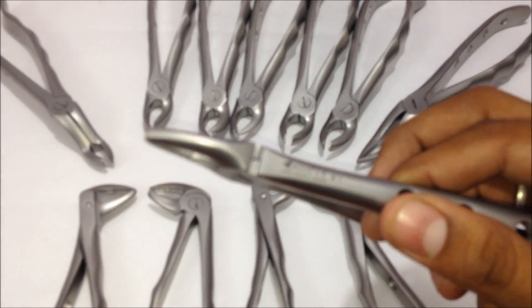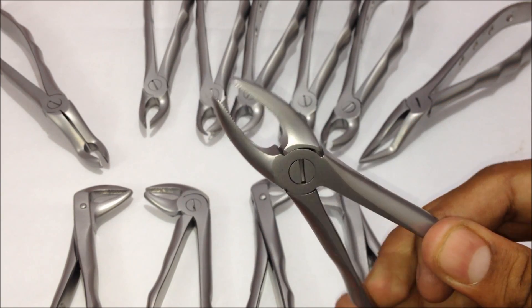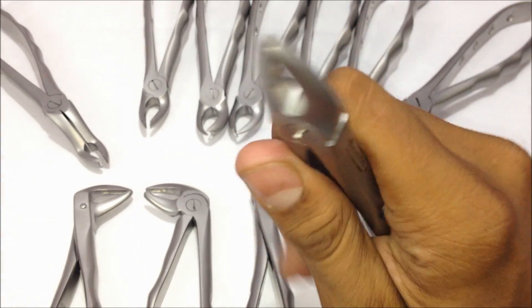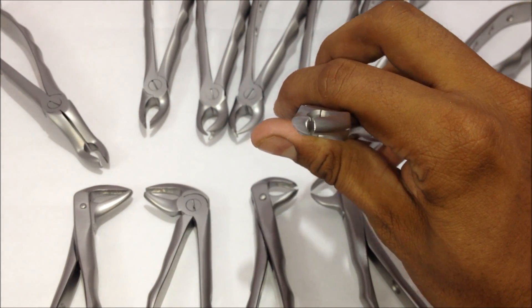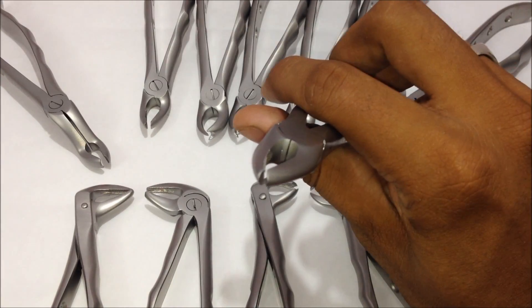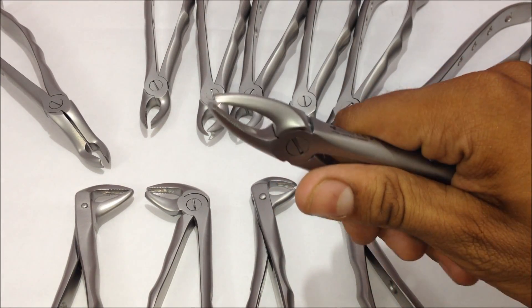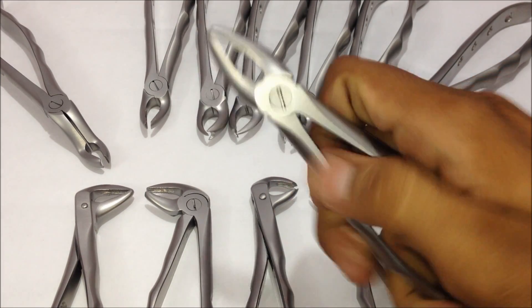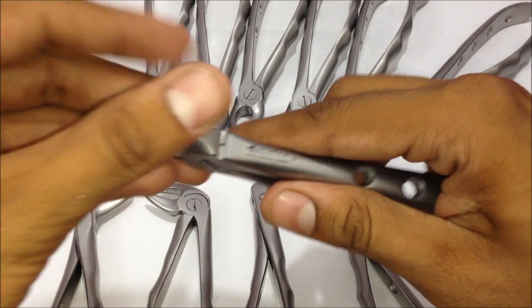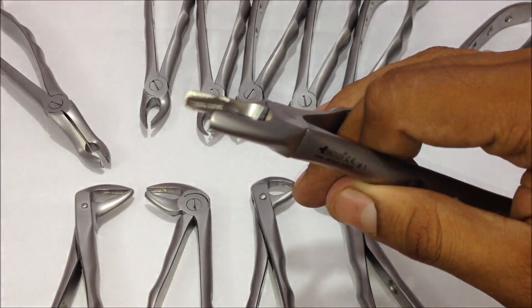Starting with the upper central incisor and canine forceps — you can see the distance between the two beaks is minimal so that it can have a proper grip on the tooth. This is the hinge area of the forceps, and you can see the serrations in the beak.